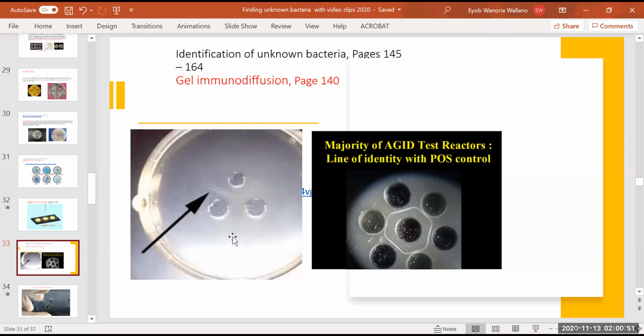The technique here, I'm going to explain to you. Look at this one. For example, these can all be antibodies or all antigens, and then this is antibody. So this antibody is going to recognize all the antigen. Or this is antigen, and these are all antibodies recognizing, and they are making precipitation. Isn't it interesting? Very beautiful. That is how we say immunodiffusion or gel immunodiffusion. This comes in so many ways. I'm going to cover this in our lecture on chapter 22, serological reactions.